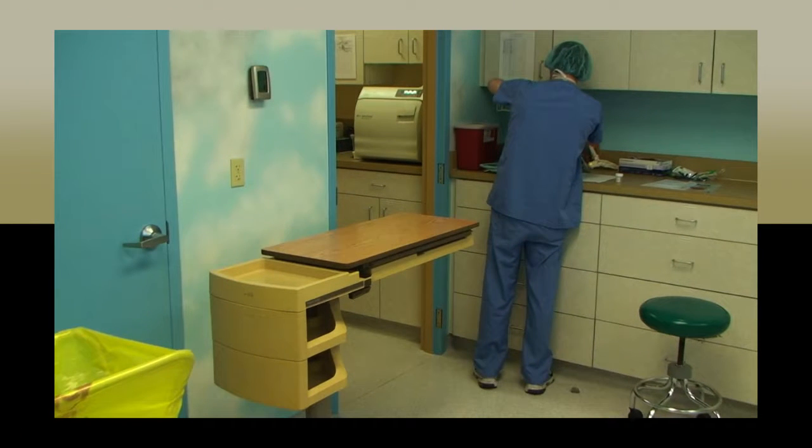Before opening the sterile field packaging, make sure all the furniture is placed in the position it will be utilized during the surgical procedure, including proper back table position and stand position, as well as equipment position. Inspect all sterile field and instrument packaging to ensure the sterile strip indicates proper sterilization and there is no evidence of strike-through. Confirm the expiration date if present.